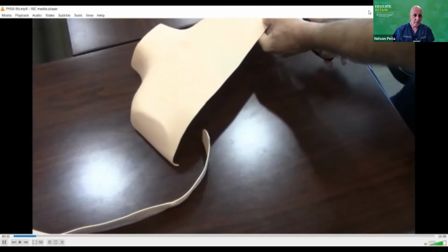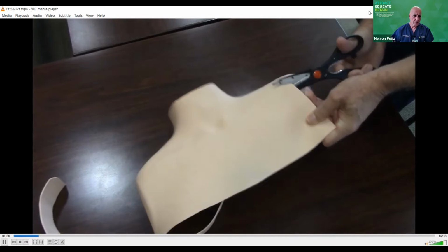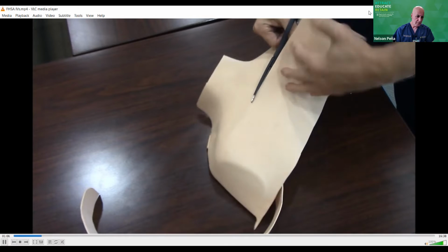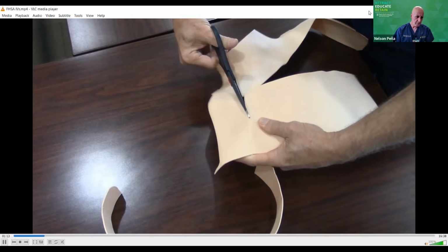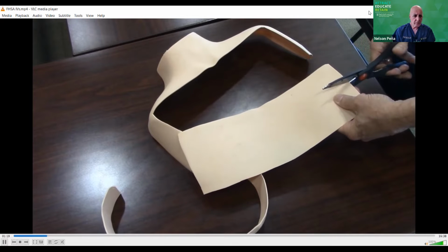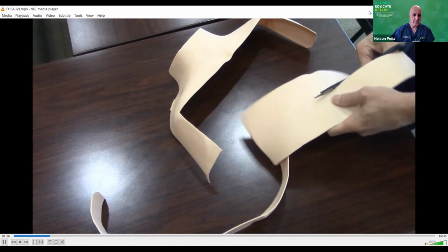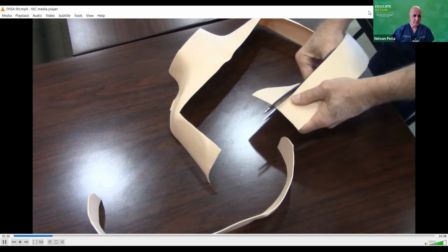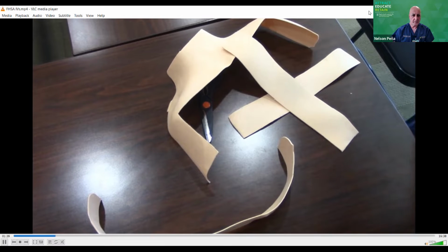And now I'm going to stay on the inside of the fold, obviously, because I want a smooth piece of plastic. I'm just going to cut myself a couple of these. Cut across the top. And then come across. And this should be enough for two of them. So now if I divide this in half, I have enough here to make myself two external IVs. Voila, that's what you're going to use as a strap.